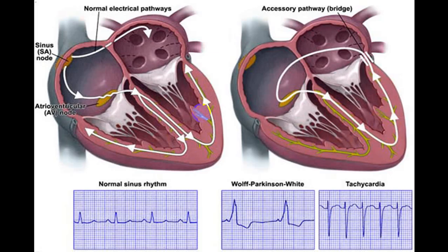Now, this particular ECG shows you that there is a wide QRS complex. P wave is just before a QRS complex. So PR interval is very short. You can see here in this particular one, there is a normal PR. This is a normal sinus rhythm. You can see a P wave, and the PR interval from the beginning of the P wave till the QRS complex is approximately 4 to 5 small squares. So this is 0.16. And you have got a normal QRS complex with T wave upright.